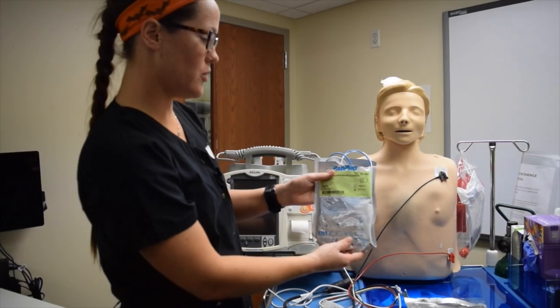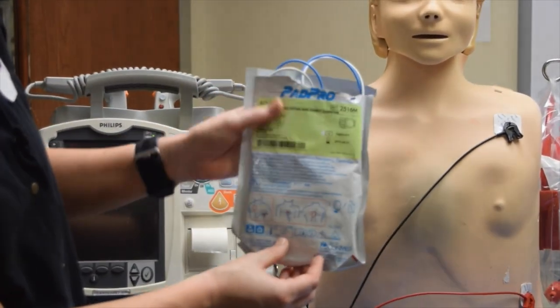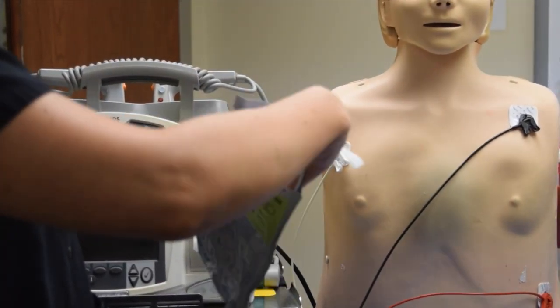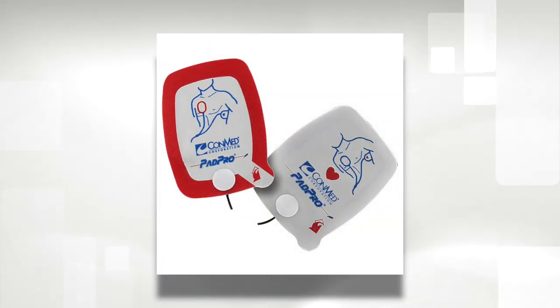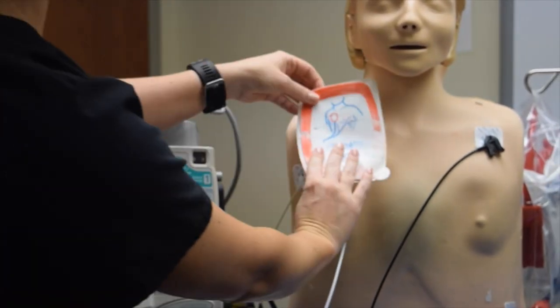On your crash cart, you noticed earlier that we had the hand-off defibrillator pads. Go ahead and open these up, and on each pad it shows you where to place. This pad shows the upper right chest, so that would go up here.